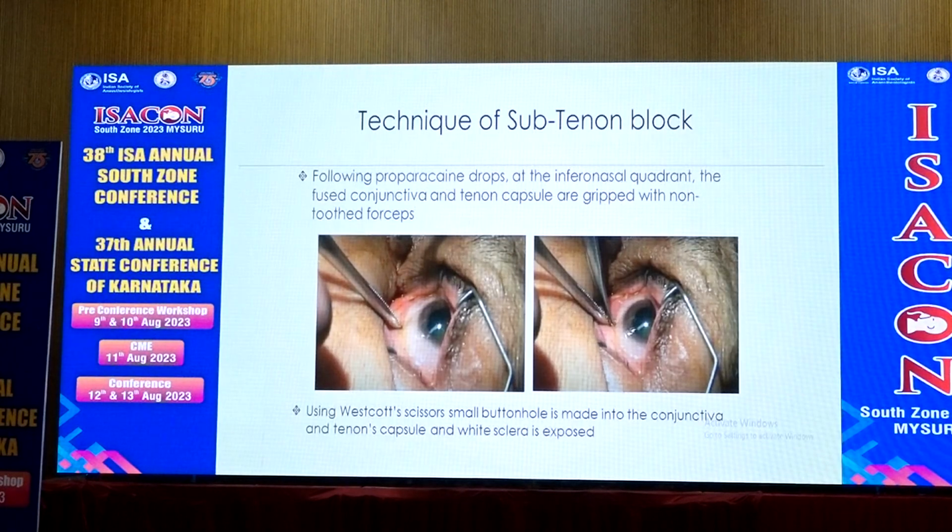So, how to enter this space? This space is entered with a blunt-tipped cannula. The blunt-tipped cannula per se has an added advantage when compared to a sharp needle one, which is a blind technique.